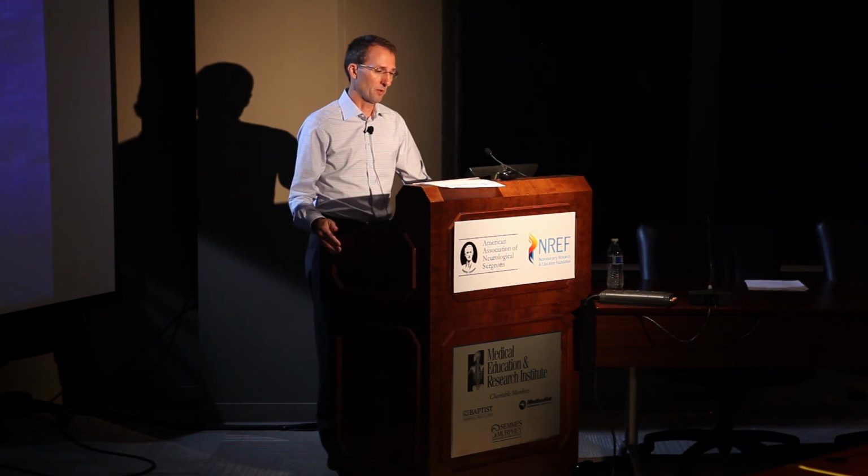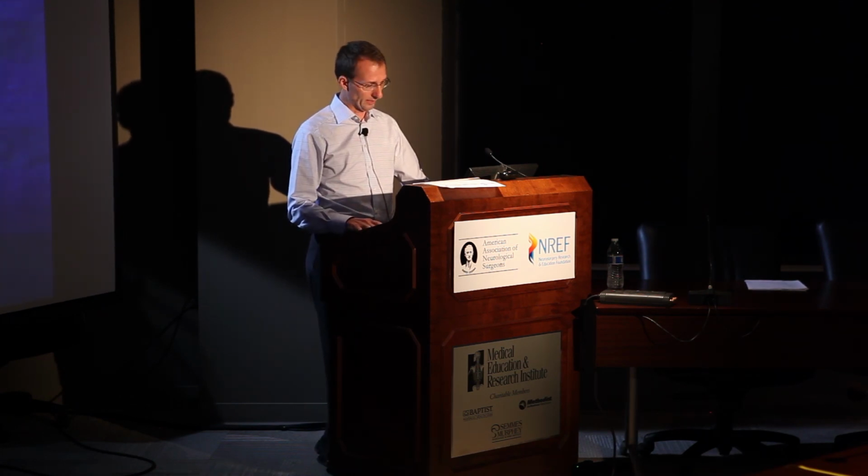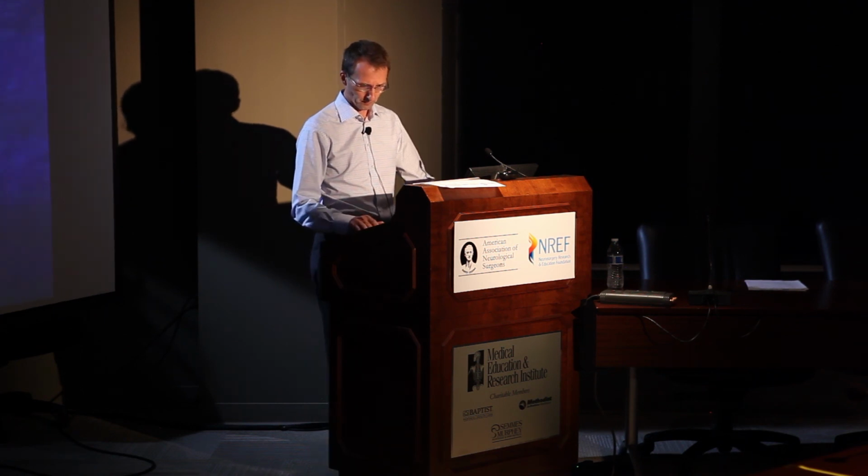So the patient was actually symptomatic with a field cut with this tumor, and that was actually handled. We embolized the tumor. He had a surgical resection, and then was going to come back about 3 weeks later for us to do a treatment of his fistula. Now, what are the options?